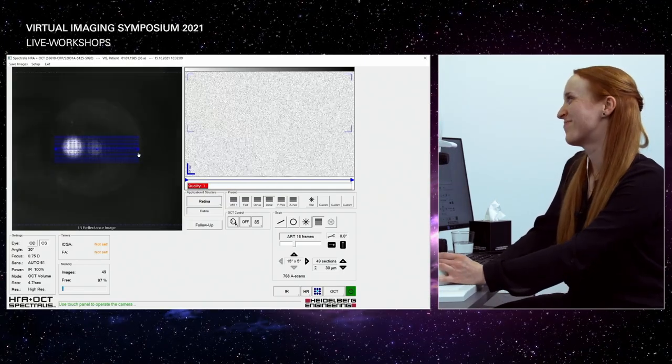Yes, I think so. The next question belongs to illumination and brightness control. So there's the possibility to do it automatically or to do it manually. Can you please show how to do the preset for manual adjustments? There's one possibility to do it only for one examination, for the actual one, or to do it as a default setting?